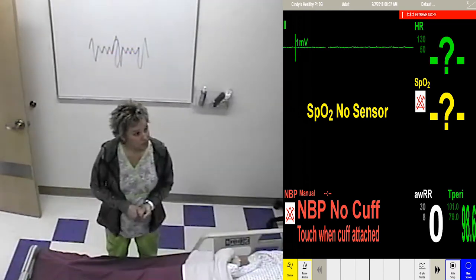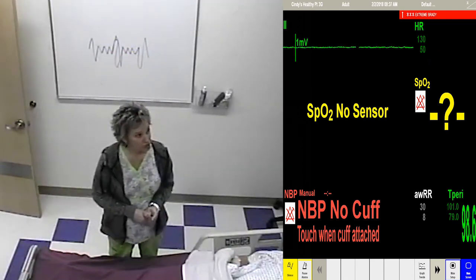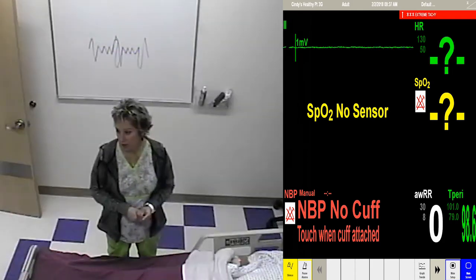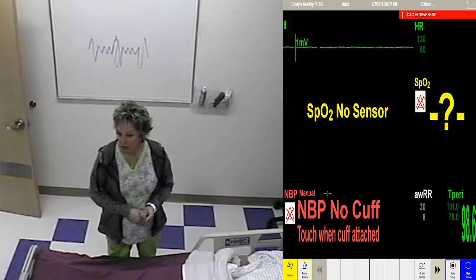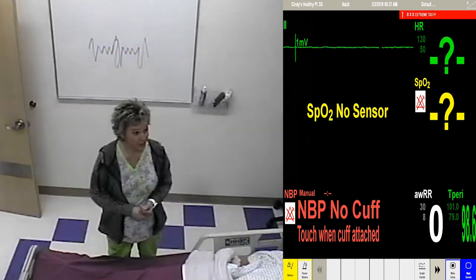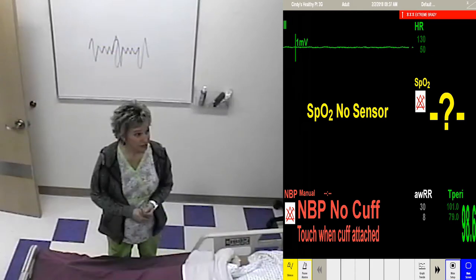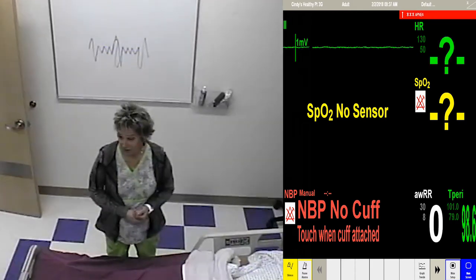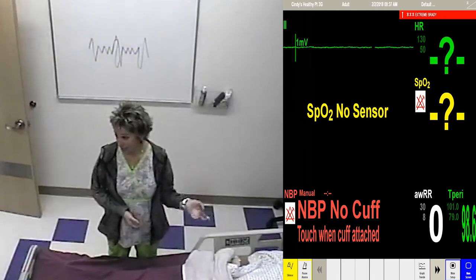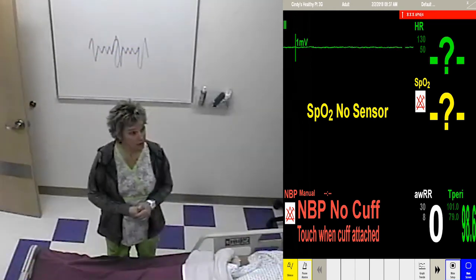Sorry. Are there P waves? No. QRSs? No. Ts? No. Is there a P before every QRS? No. Is there a T after? No. Bob your head? No. We got nothing to bob to. Okay, this rhythm is asystole. A means without. We don't have anything. Are they dead? Yes, they are.